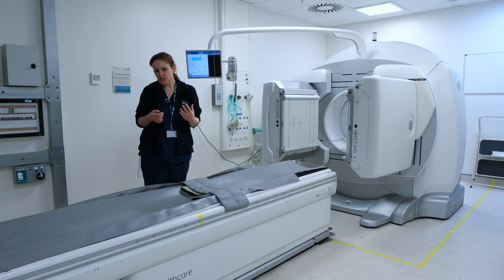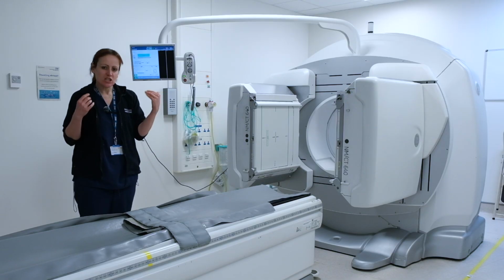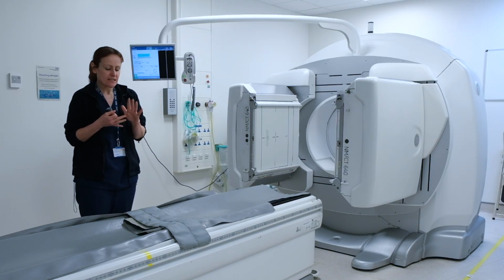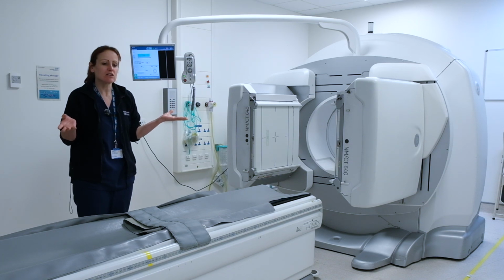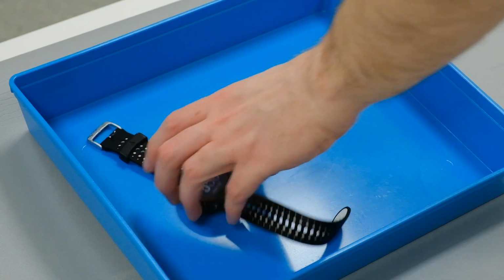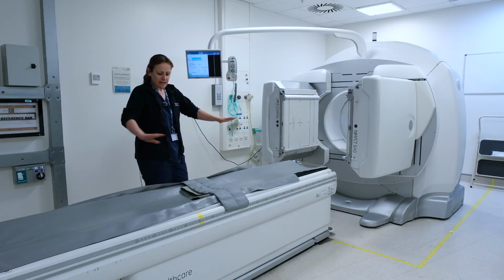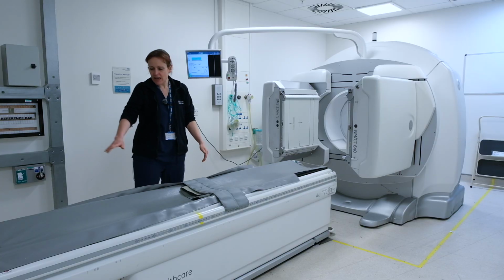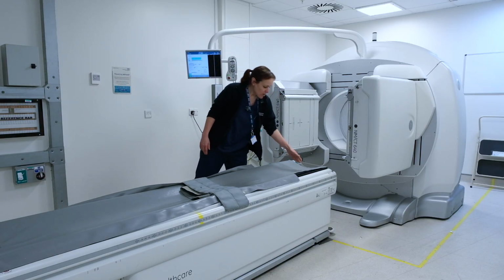So when a patient returned after the 3 hours, we would bring the patient into this room. We would check their ID again, so name, address and date of birth. We'd also ensure that the patient had no big metal items around the body, so we'd ask them to remove belts, watches, coins, keys, anything like that in the pockets. We'd then get them to lie down on the scanning couch, so the head would be positioned about here and the feet would be about here.